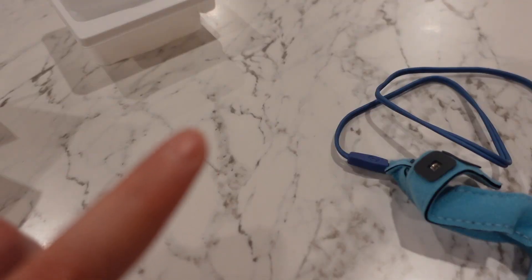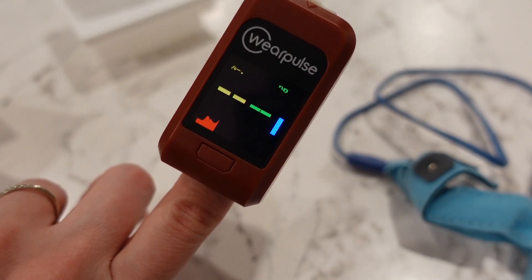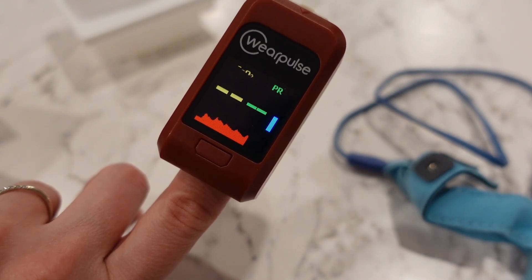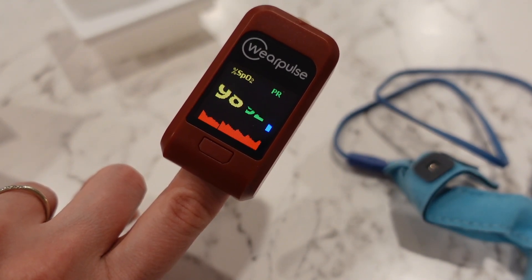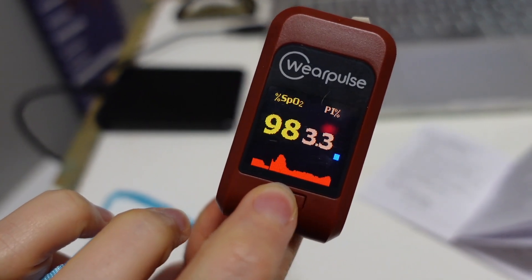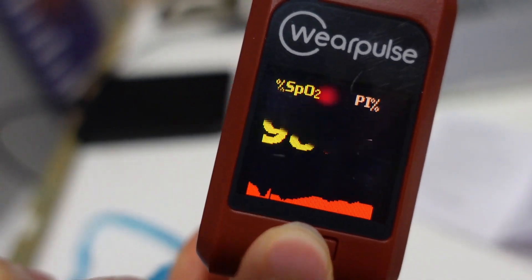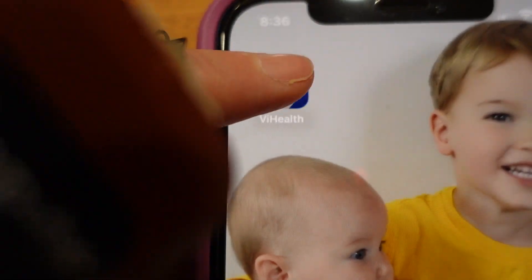You don't have to turn it on or off. When you put it on your finger it automatically turns on, and when you remove it it turns off. You can use this device on its own to see the readings on its screen, or if you want to store your information you can download the VI Health app and connect the oximeter to it.